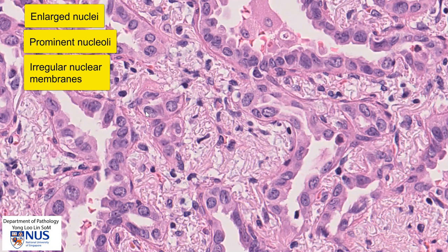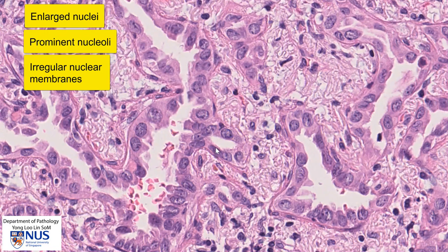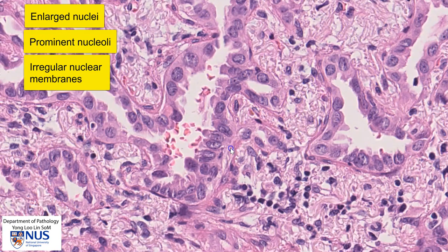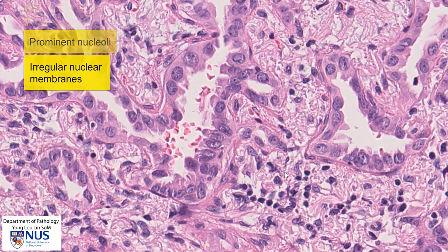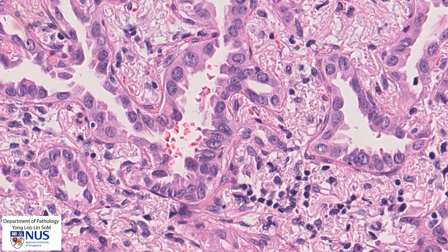Again, you can see the irregularity of the nuclei. So we have nuclear enlargement, irregular nuclear membranes, and prominent nucleoli — these are features of malignancy. Another feature seen here is the raised nucleus-to-cytoplasm (NC) ratio, meaning the nucleus is relatively large and occupies a lot of space in the cell relative to the cytoplasm. We have high or raised NC ratios here. And again, you can see the prominent nucleoli in the malignant cells.